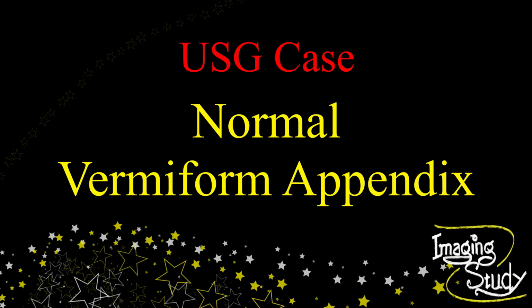Today we are going to see a case of normal vermiform appendix. Normal vermiform appendix is usually not visualized on ultrasound. If you check carefully, then you can get it in some cases. So today I'm going to show you one of them.